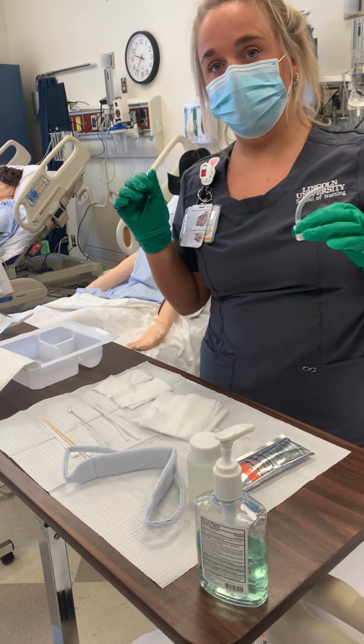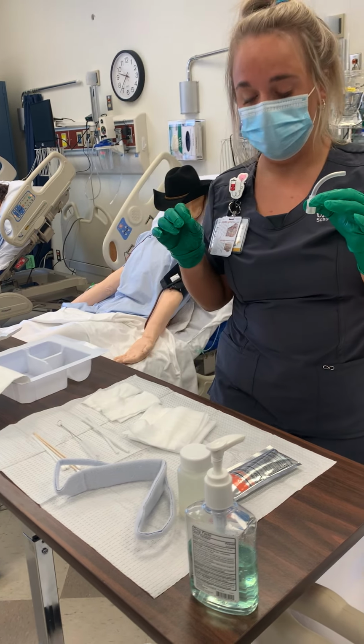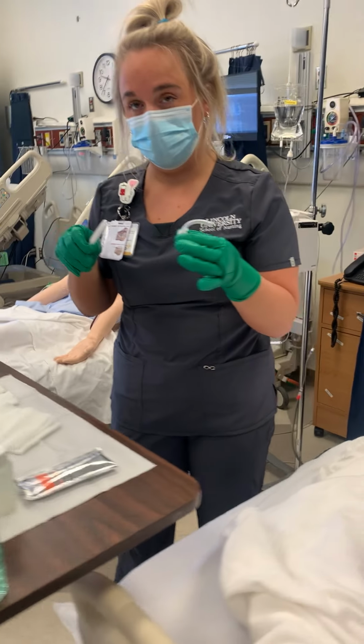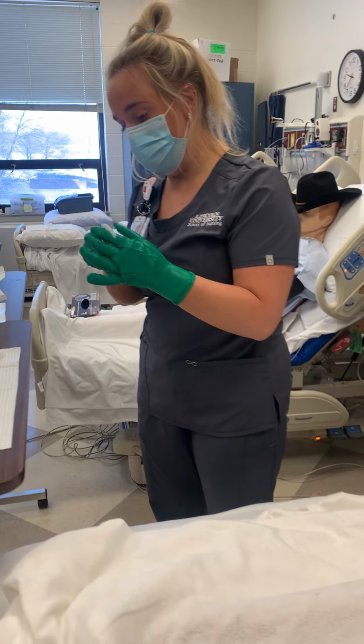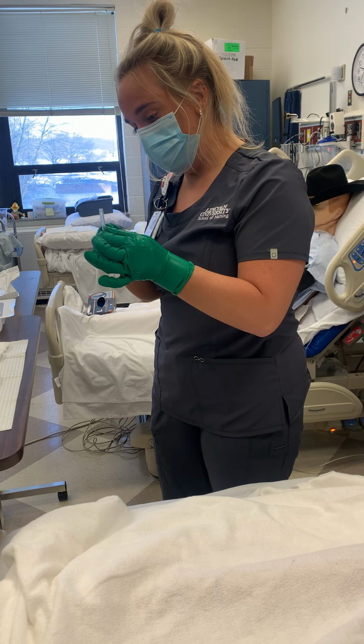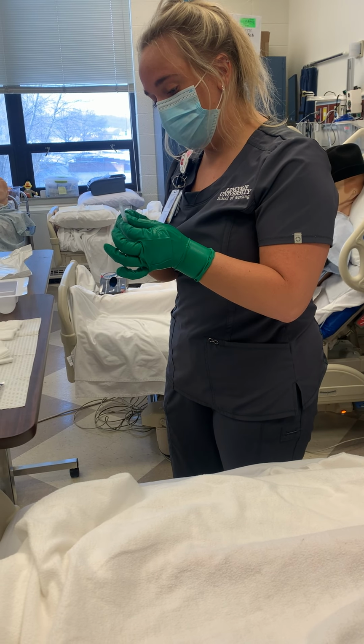And then, with my sterile hand, I can grab my cleaning supplies and go ahead and clean it. I'm going to clean it not over my sterile field, I'm going to clean it over my trash can, making sure to just have a good hand on it and making sure it's really clean.